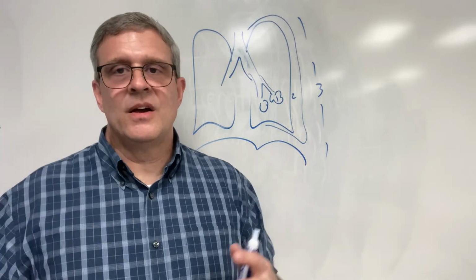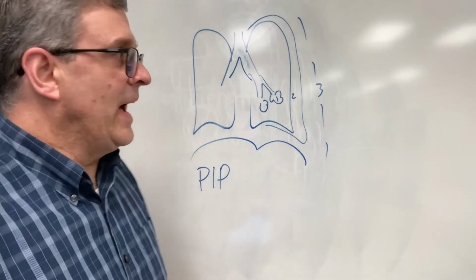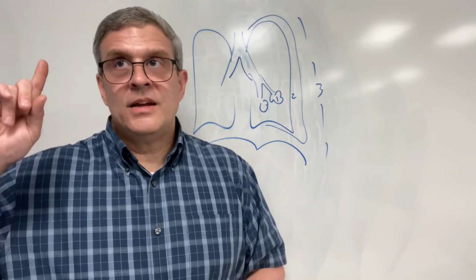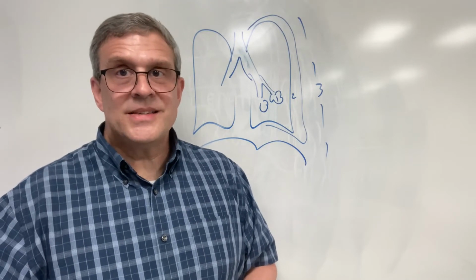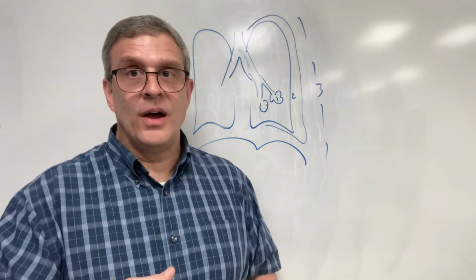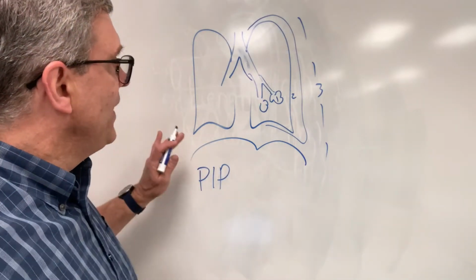How stiff is that lung? And so to do that, remember, and this is key, remember that to have airway resistance, you have to have moving air because it's resistance to airflow. So you have to have moving air.